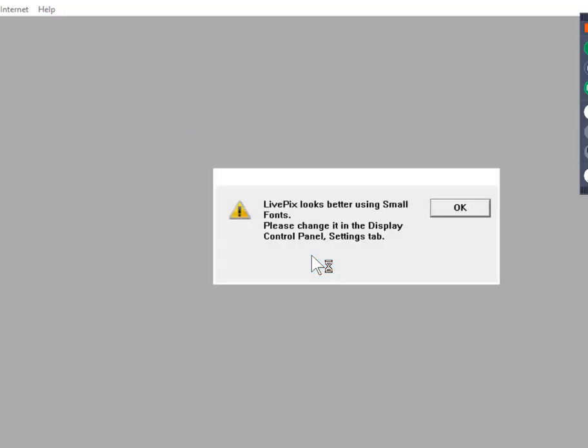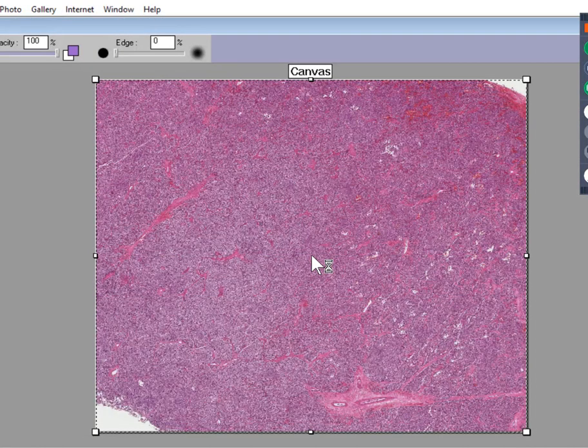Oh, it's working fast now. And my God, all you see is one big clump of cells. Well, what if I told you that this one big clump of cells was almost an entire testicle? So there's a testicular tumor.